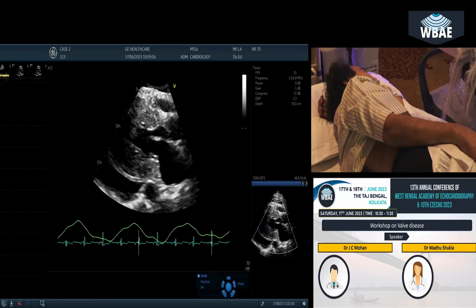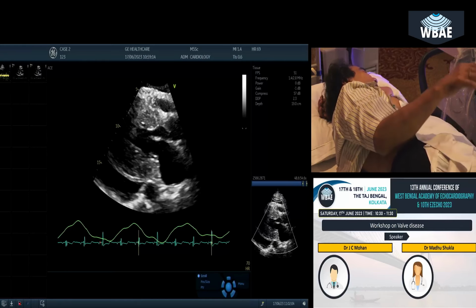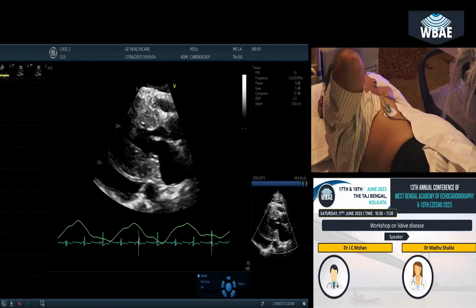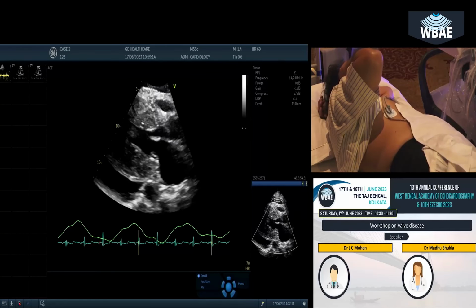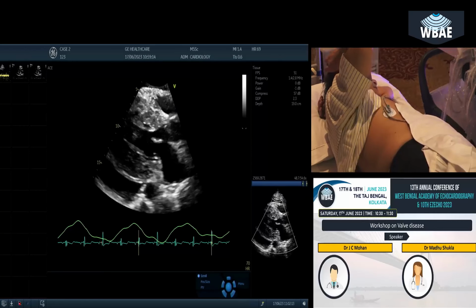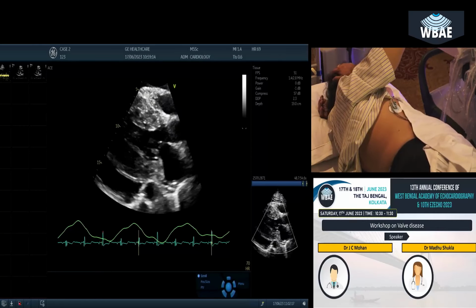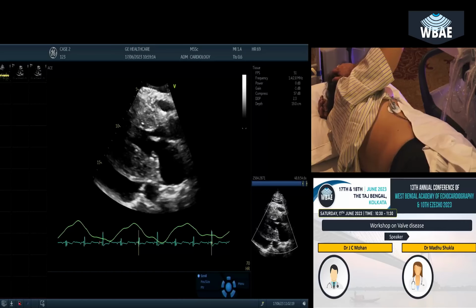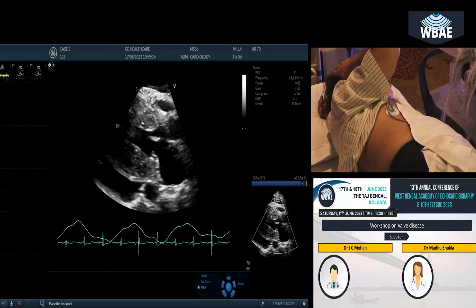Now, the question is, how do you decide between the two on echocardiography? The first thing is, look at the mitral valve carefully. Not for SAM, not for ASH, which of course have been described in cardiac amyloidosis, but we want to see the length of the anterior mitral leaflet and thickening. Those are structures which are peculiar to hypertrophic cardiomyopathy.